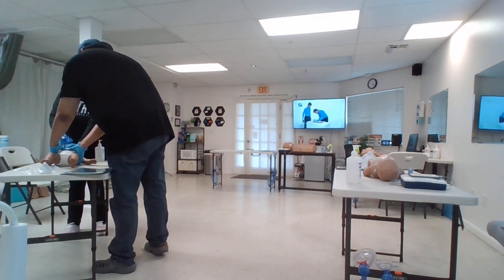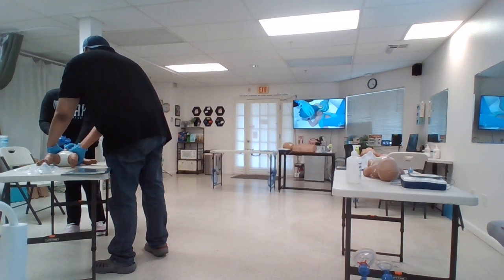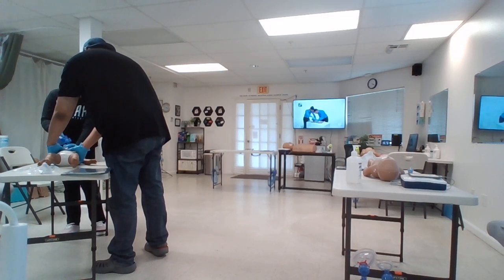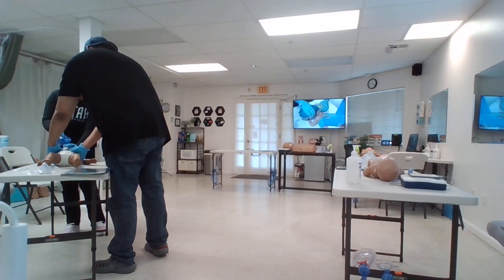CPR. 1, 2, 3, 4, 5, 6, 7, 8, 9, 10, 11, 12, 13, 14, 15. That's right. 1, 2, 3, 4, 5, 6, 7, 8, 9, 10, 11, 12, 13, 14, 15. That's right.